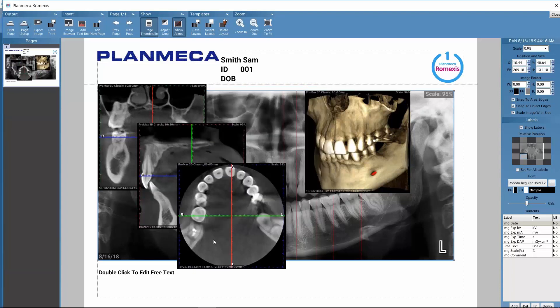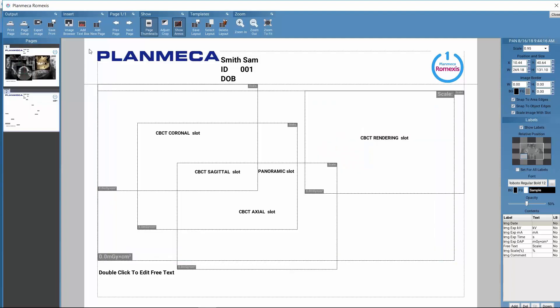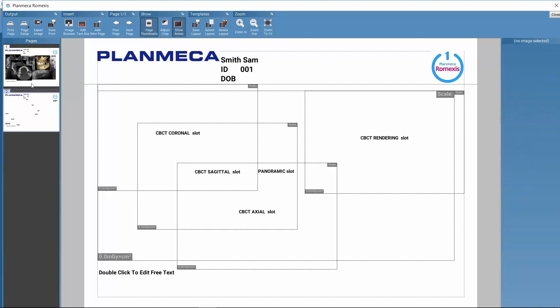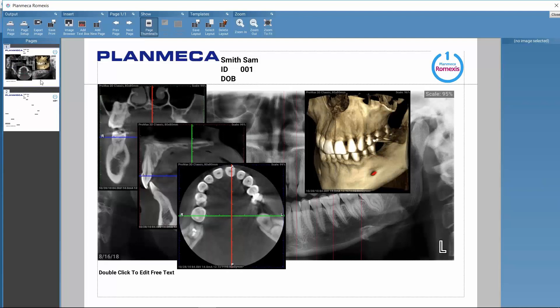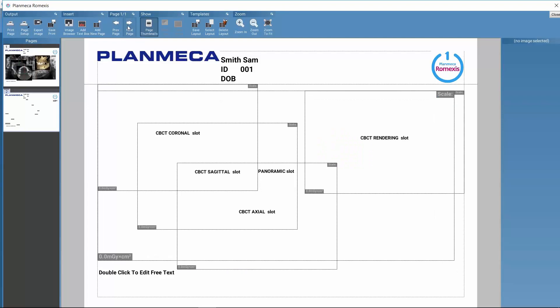This page looks a little crowded, so let's add another page to our printout. In the upper toolbar there is a function for adding new pages. We can choose to add a completely empty page or a copy of the current page with the same image slots. Let's add a copy. On this second page we see the corresponding image slots already defined, but we don't have any images yet. To navigate between pages, we can use the thumbnail view and click on the page we want to work on, or use the navigation arrows. If we want to hide the thumbnails, we can click here.